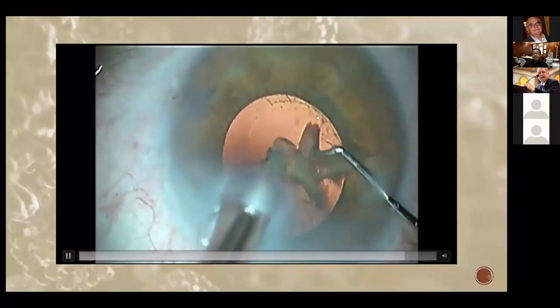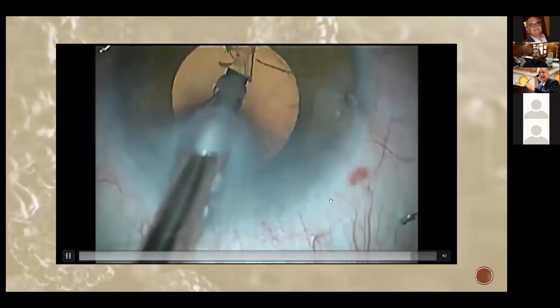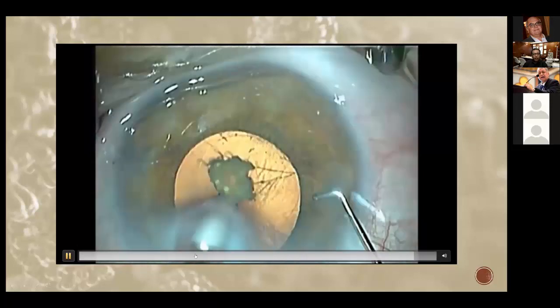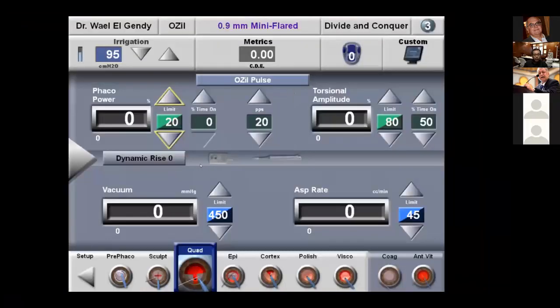I will show you on the settings of my phaco machine. How do I achieve that? I change my flow rate as I finish my phaco. If my colleagues would allow me, I will change my screen right now to the phaco machine. I'm very comfortable working with the Infiniti machine.